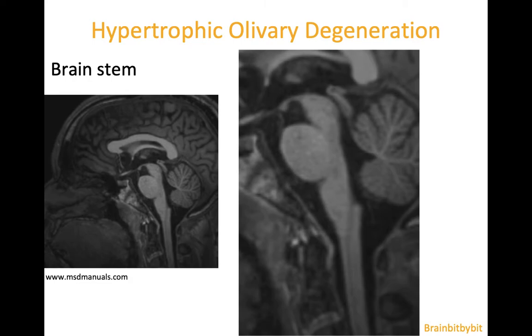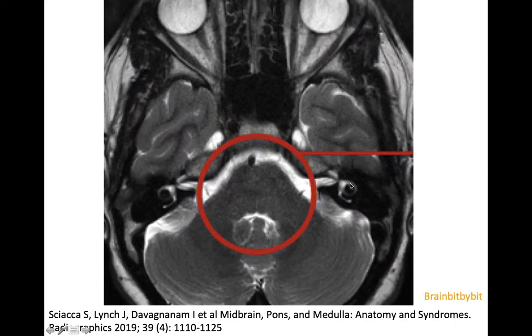If you look at the brainstem on sagittal T1-weighted images, you can divide it into midbrain, pons with its pregnant belly appearance, and medulla based on the morphology. On transverse images you can also recognize the three parts of the brainstem, and to know where you are, you can check for connection with the cerebellum — if there is a connection, you're at the level of the pons.